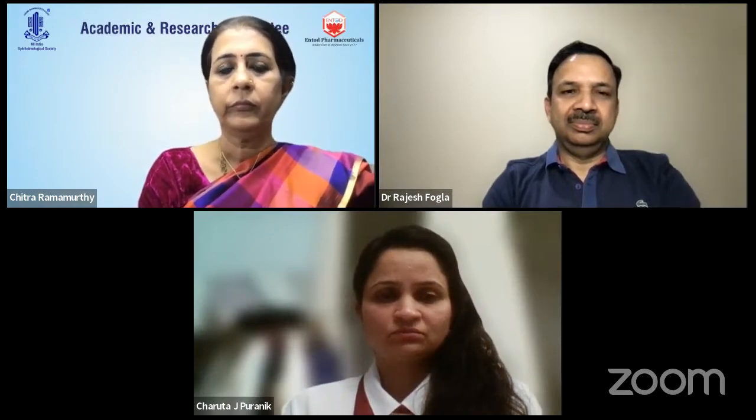So going back to the question that you asked about the different imaging modalities, different instruments, I think like you rightly said, only institutions will have access to all these things. But if you want greater tissue resolution, you probably want to use something that has better resolution. If you want to look at the lesion as a whole, then you want to use something that has reasonable resolution where you're able to see the posterior extent as well. And if you really want to look holistically at the relationship of the lesion to the anterior segment, then you have Swept Source OCTs, which can give you all the details. So there are certain indications for using each of these appliances if they are available.